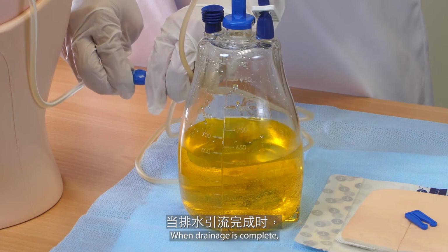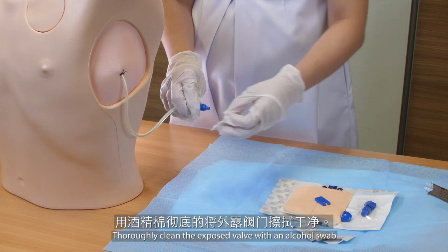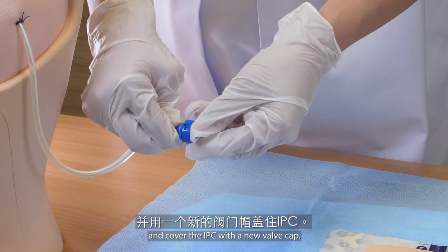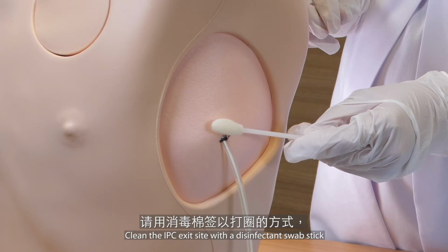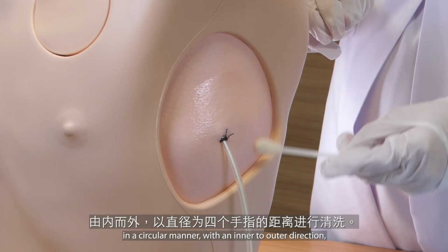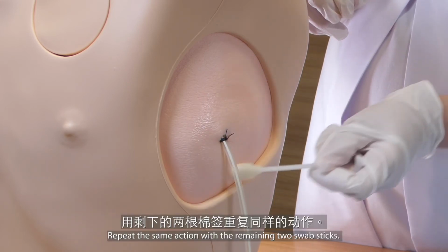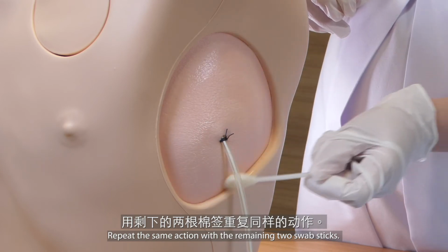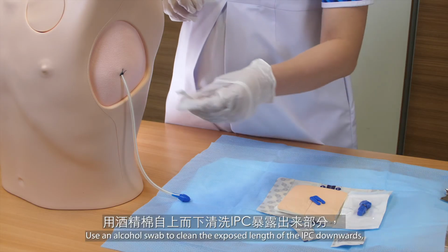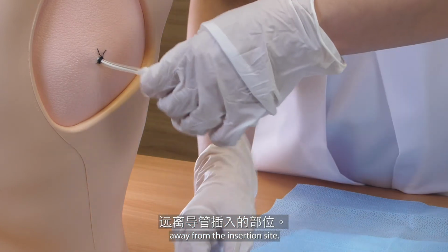When drainage is complete, unlock the valve and gently remove the access tip. Thoroughly clean the exposed valve with an alcohol swab and cover the IPC with a new valve cap. Clean the IPC exit site with a disinfectant swab stick in a circular manner with an inner to outer direction for approximately 4 finger breadths in diameter. Repeat the same action with the remaining 2 swab sticks. Use an alcohol swab to clean the exposed length of the IPC downwards away from the insertion site.